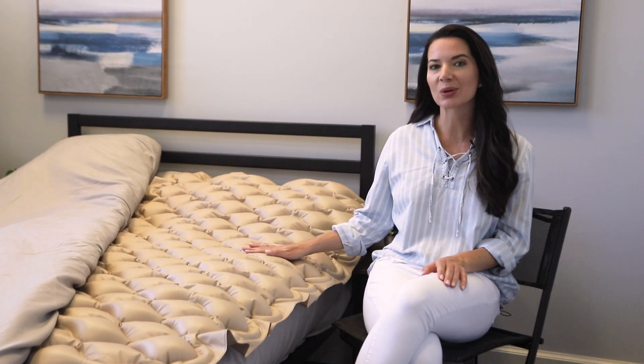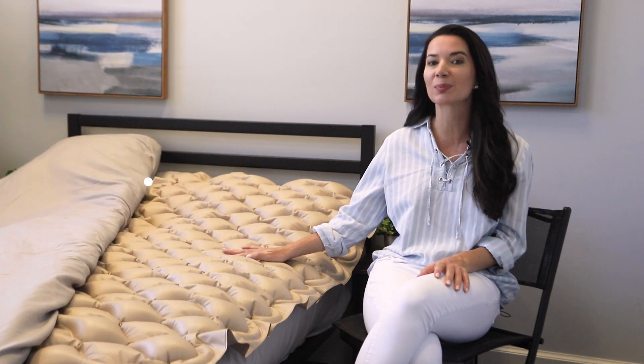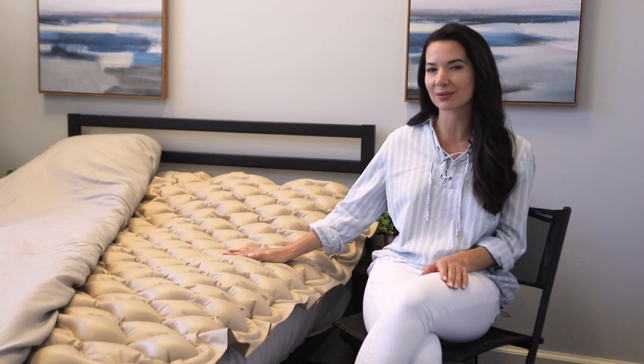The mattress is also equipped with a low pressure alarm that alerts caregivers when pressure falls below the recommended level for safe, effective use.